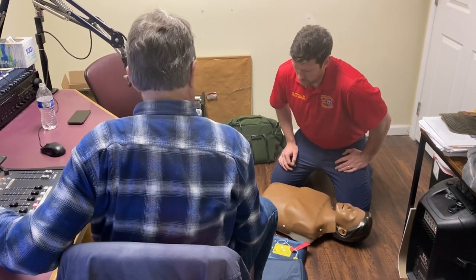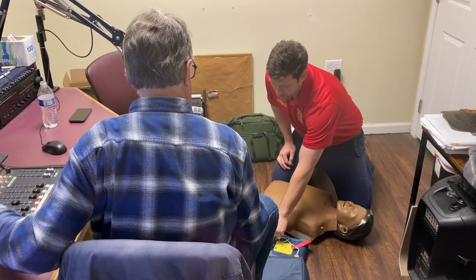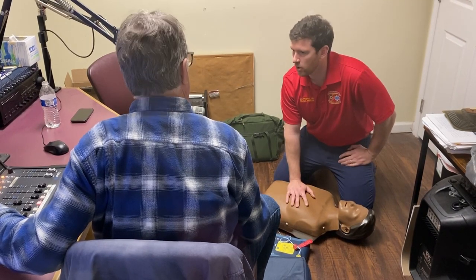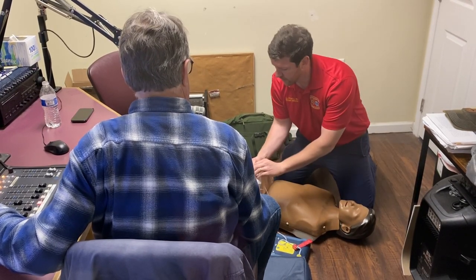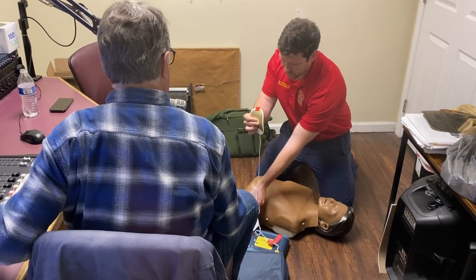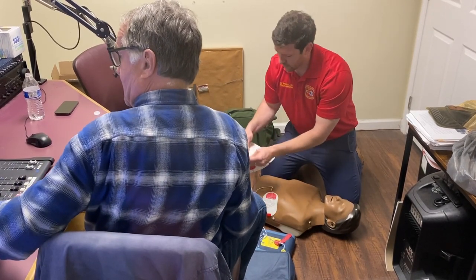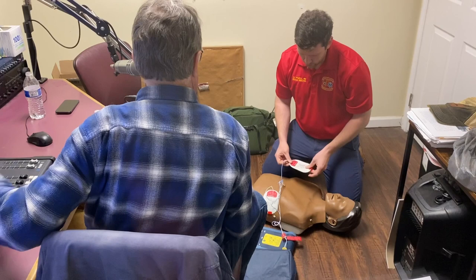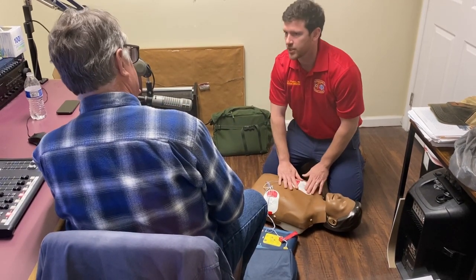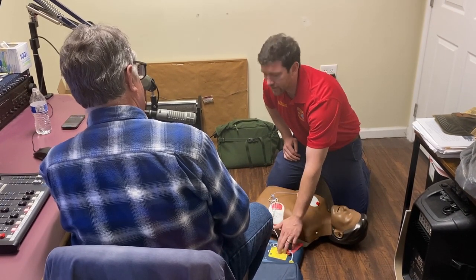Remove clothes from patient's chest. You can see it starts telling you prompts. It's just told me to expose the patient's chest wall because I'm going to have to put pads on. I'm looking at the pads and they have pictures. This pad tells me to put it on the left lower chest wall — that's at the base of the apex of the heart. The other one says to put it on the right upper chest wall. I just put it on where the sticker shows me. Then I just listen to this machine — it's going to tell me exactly what to do.